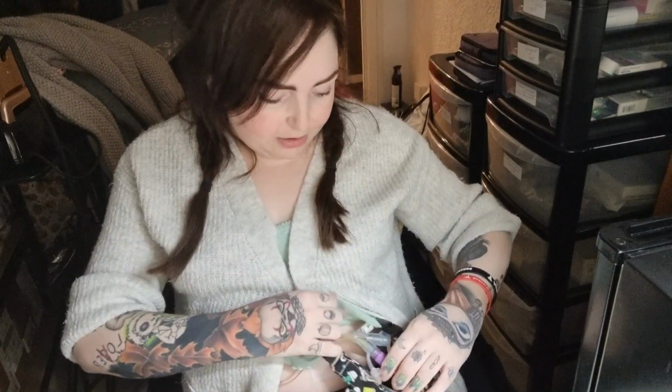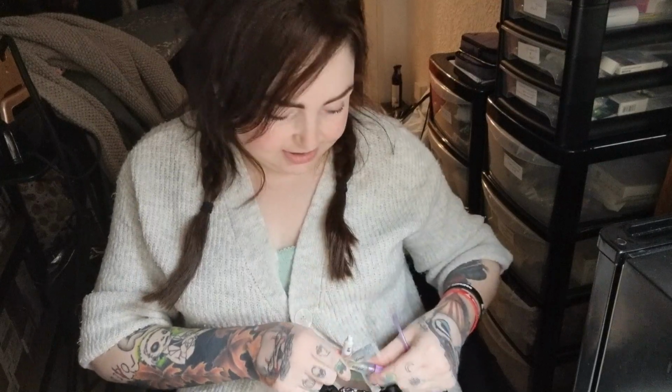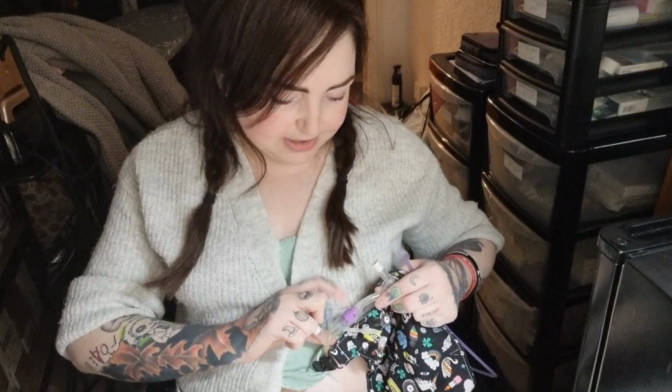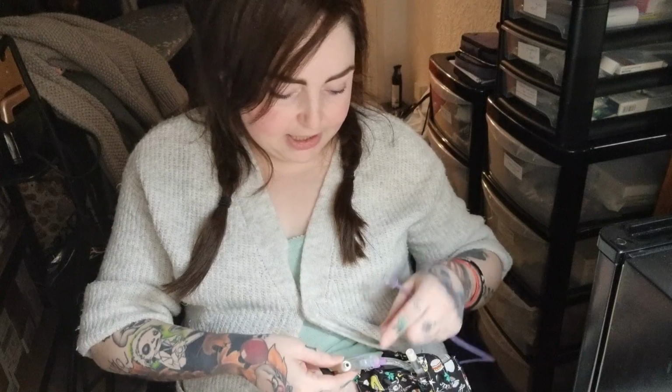So then we take this. This is my drainage bag cover to cover up all my stomach contents that are inside this bag. You don't want to see that. It's disgusting. But you get the little end. This is the jejunal area. Can you even see that? No. That doesn't make it easier to see. So this has got 2 ends on it. This part is the gastric end, and that goes into my stomach. So all my stomach contents empty out. So if I have a cup of tea, then it pours out like a fountain. Just right back out. And the jejunal end, that goes into my jejunum, and we connect feeding water to that.